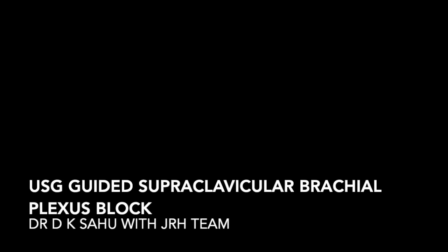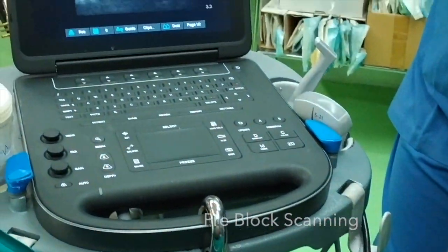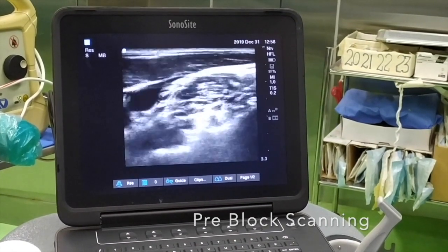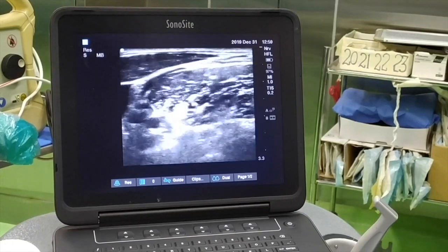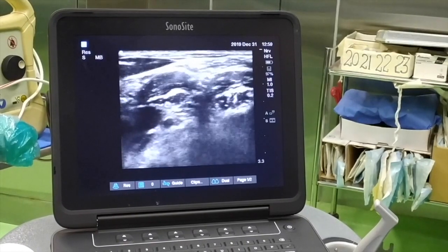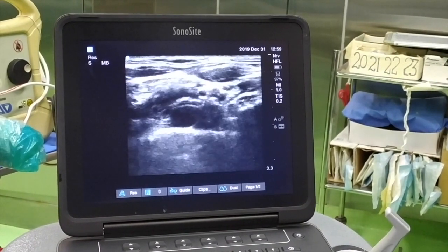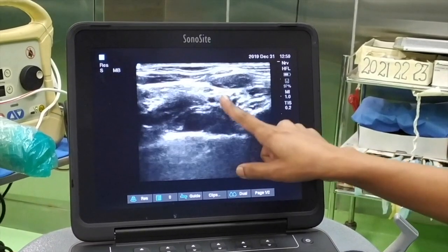Hello everyone, I am demonstrating here a supraclavicular brachial plexus block, ultrasound guided. We should start scanning from medial to lateral — thyroid, carotid artery, IJV — and we should identify the sternocleidomastoid muscle, then the anterior scalene muscle and medial scalene. In between there is the brachial plexus, with roots converging behind the subclavian artery.